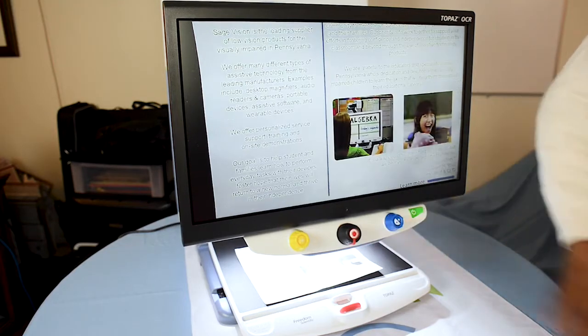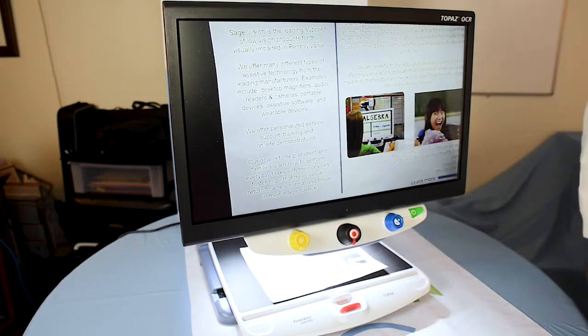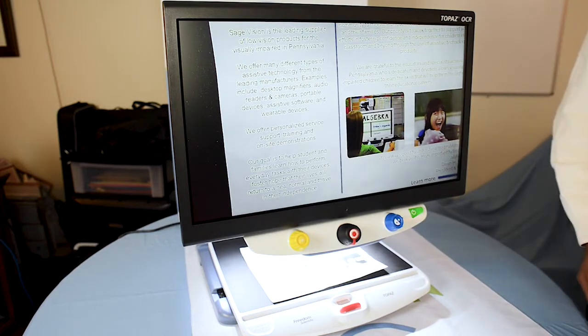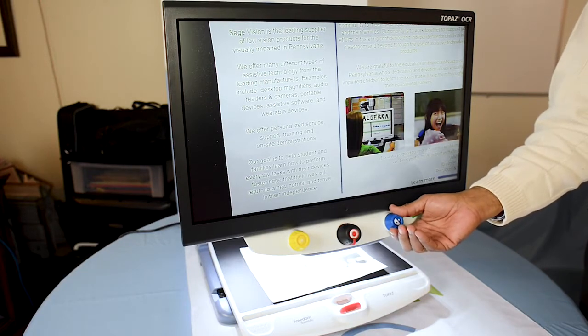The next feature I'm going to show you is the contrast feature. This is the blue knob all the way off to the right. There are 16 different contrast modes, and right now this is in standard color mode.